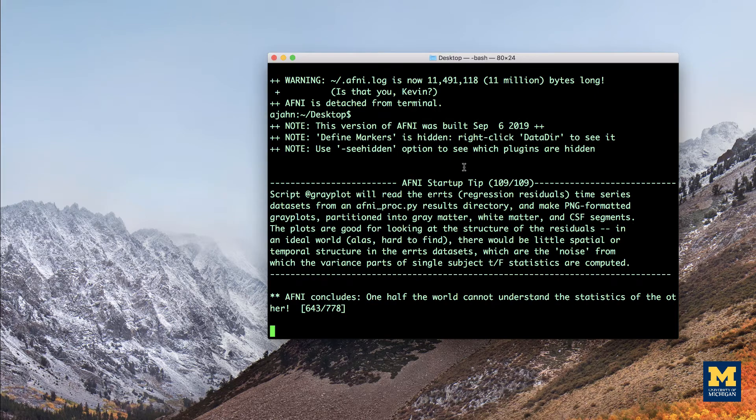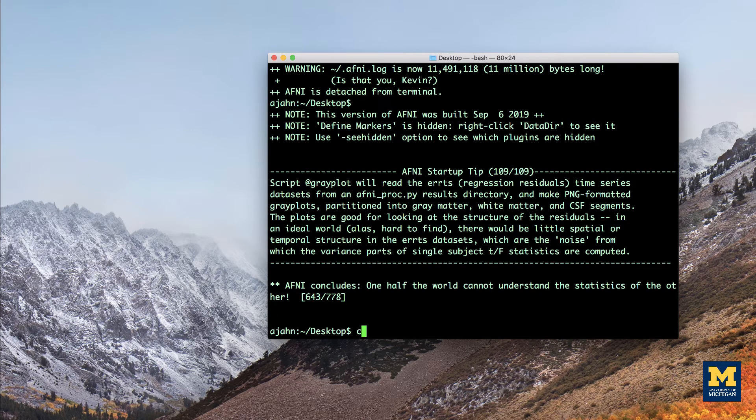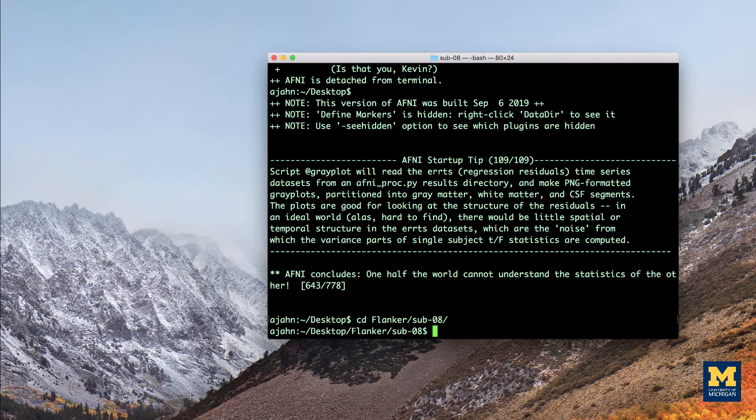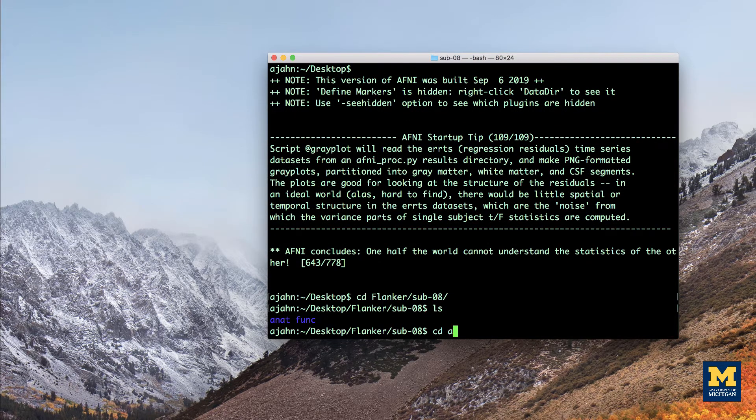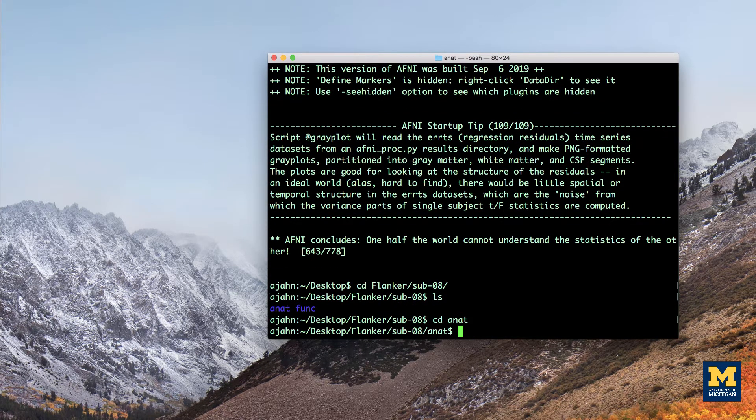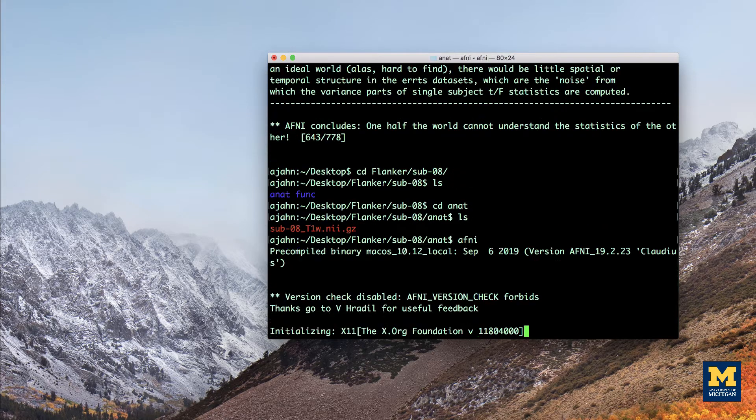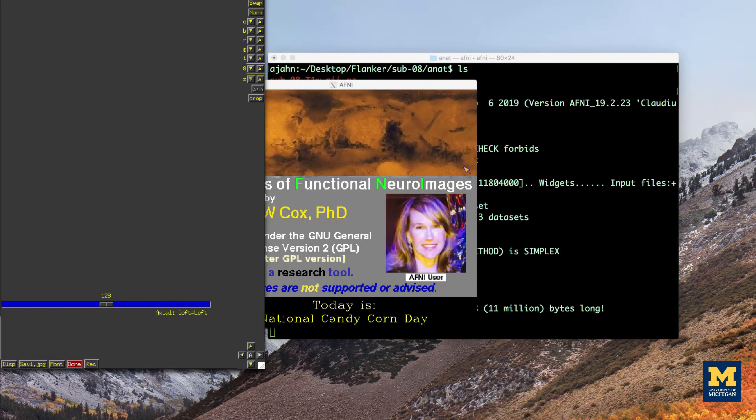Close the viewer, and then navigate to the sub 08 directory within the Flanker data set, and then navigate into the anat folder. From here, type AFNI and then press return, which will open the GUI.